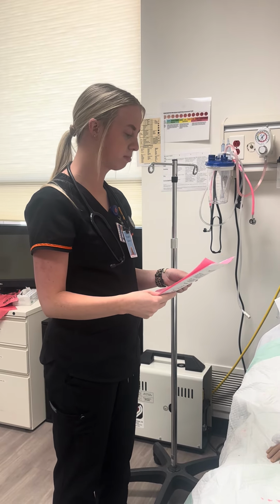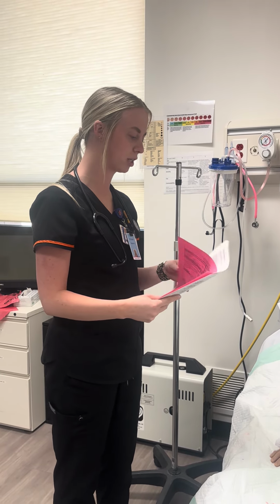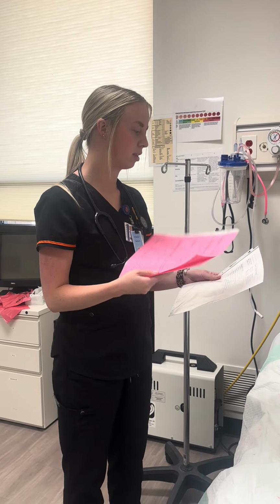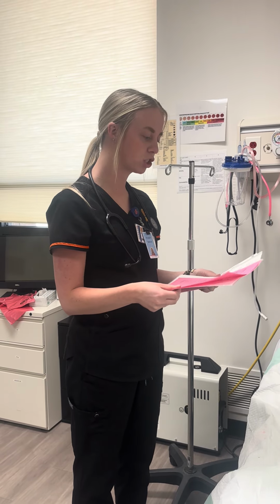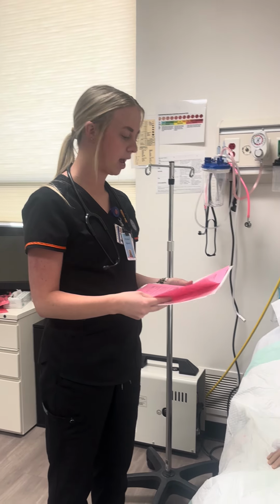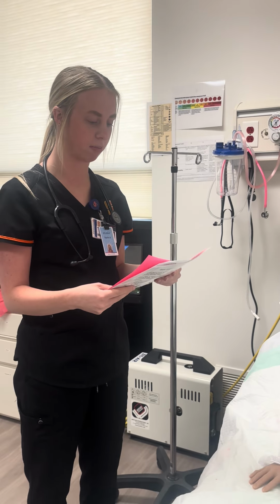Next, I'm going to explain why I'm here. I'm doing a blood transfusion. I'm going to ensure these pieces of information I have match with my patient, just have a confirmation, remind them of this consent that I have, and then have them confirm their blood type with me.